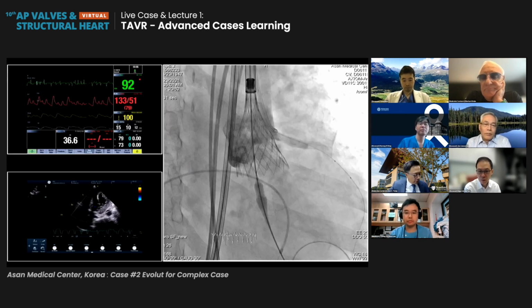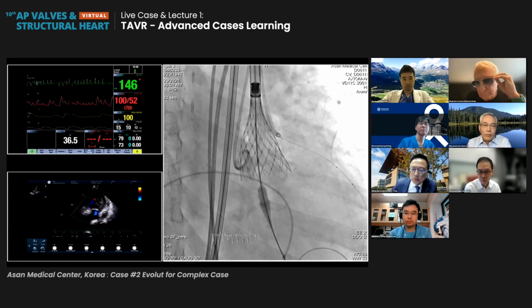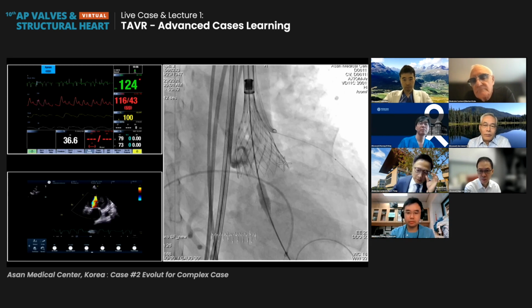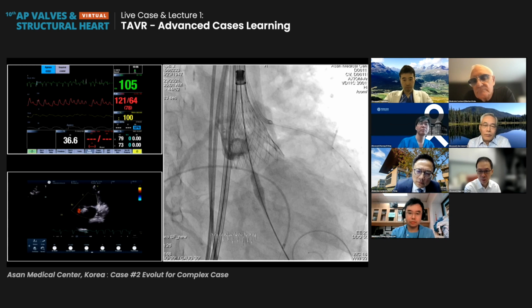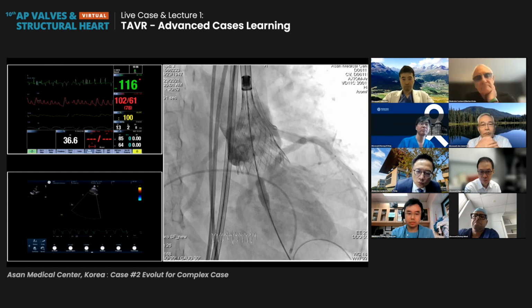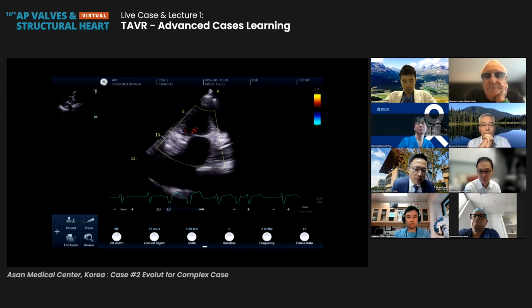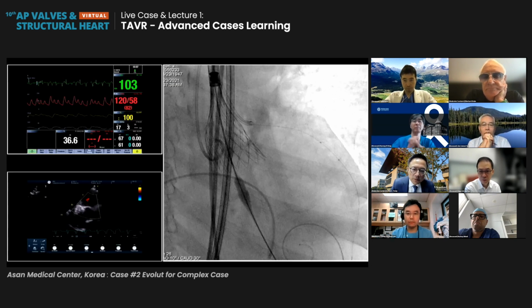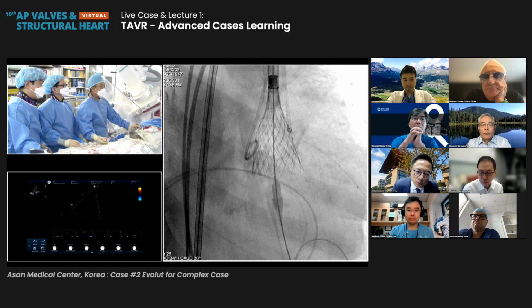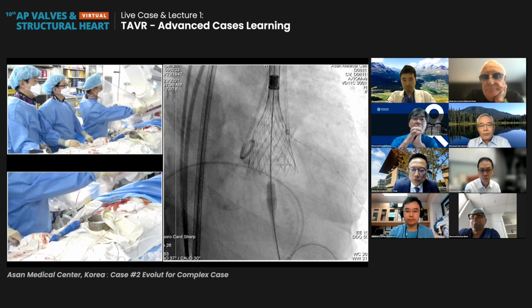So we can see the three-chamber view like this, and yeah, there's no significant AR here. But okay. Okay, got it. On the posterior side, I think the grade 2 AR here. Okay, got it. So, but I think this position is not bad. So, okay, 여기서 한번 다시 테스트를 좀 해볼게요. 요 에코 좀 잠깐만 빼주시겠어요? And slightly deeper, and considering the patient hemodynamics and the coronary height, 아니 그냥 the tricuspid 한번 가볼까? View and this position would be the best option for that.